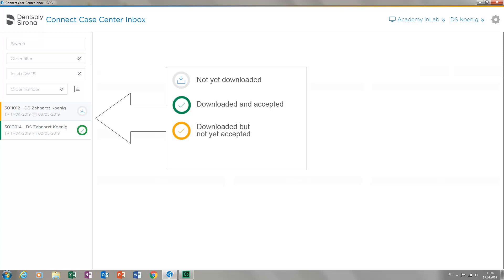If this icon is displayed in orange, it indicates that the case has been downloaded but not yet accepted. In other words, it is a pending order. The blue icon indicates that you rejected the case.